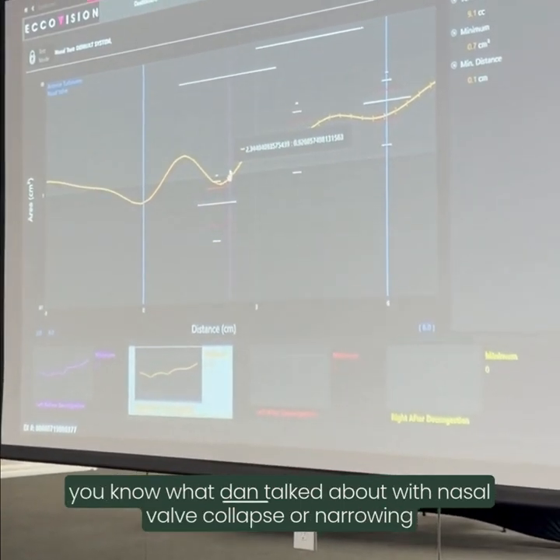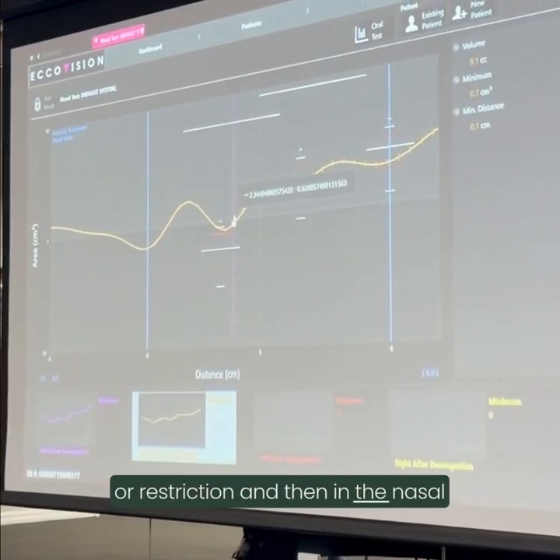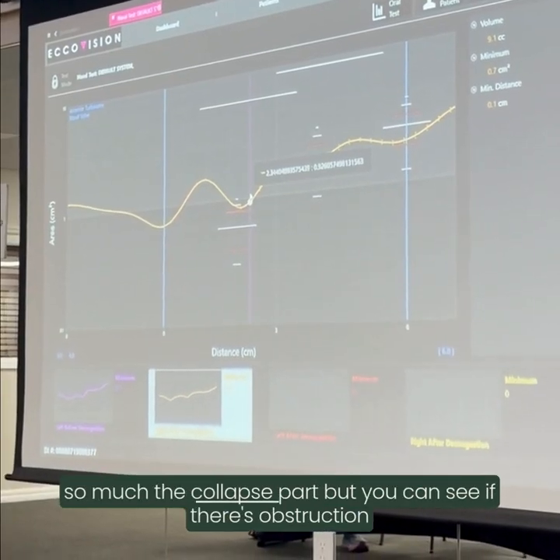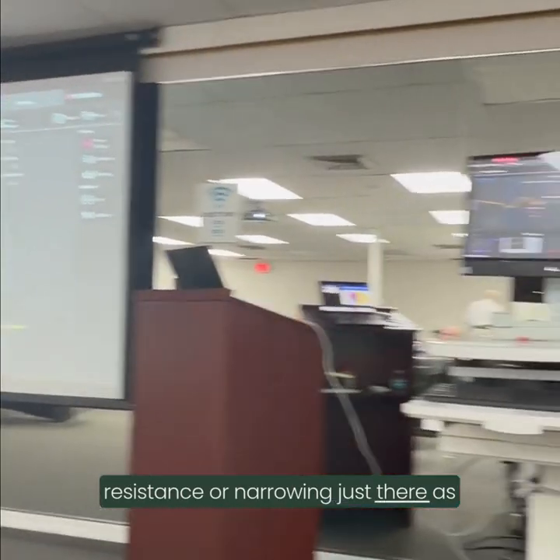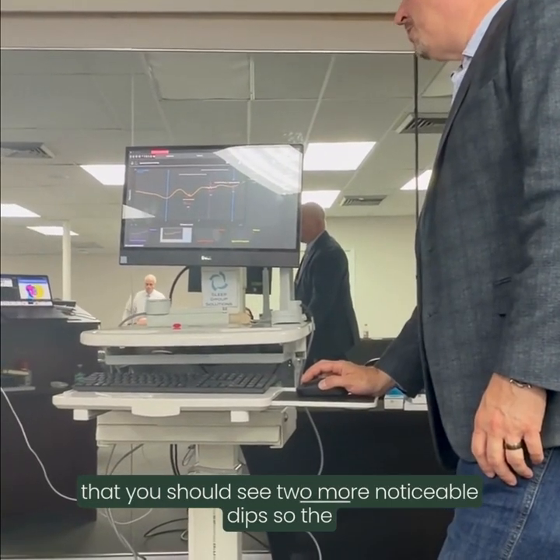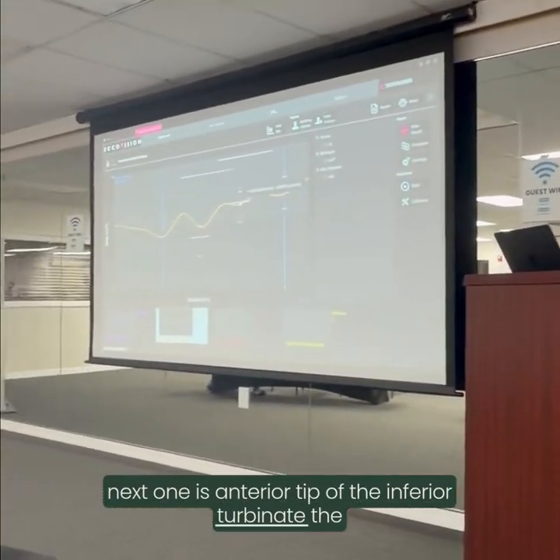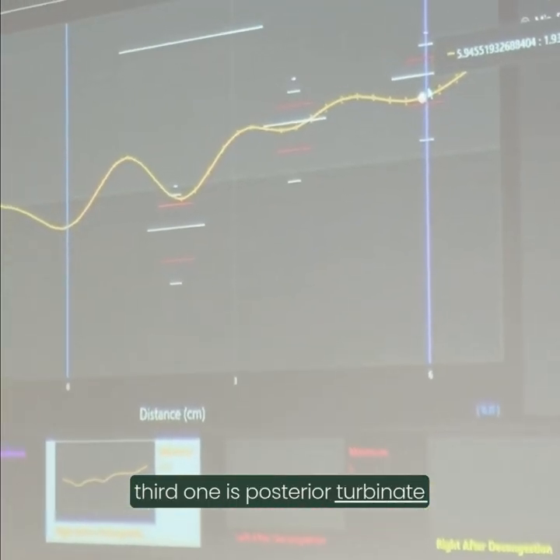So, what Dan talked about with nasal valve collapse or narrowing or restriction in the nasal valve specifically, you can see that real clear here. Not so much the collapse part, but you can see if there's obstruction, resistance, or narrowing just there. As you travel behind that, you should see two more noticeable dips. The next one is the anterior tip of the inferior turbinate. The third one is posterior turbinate tissue.